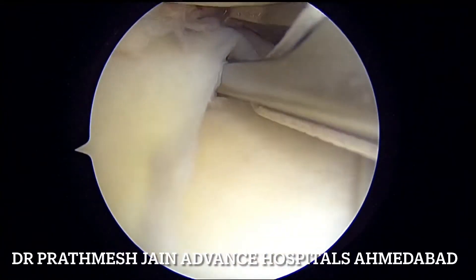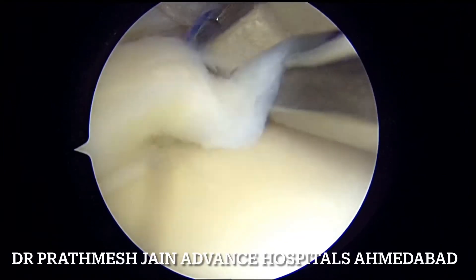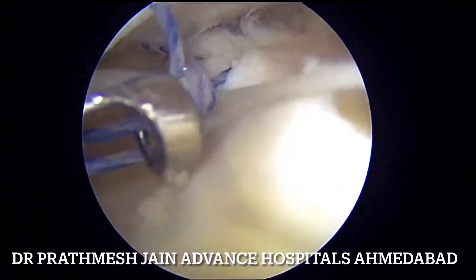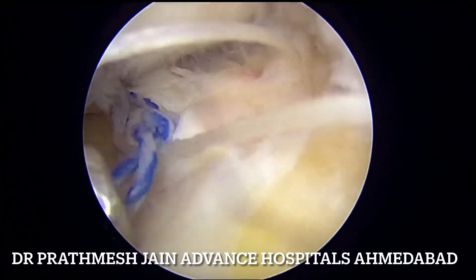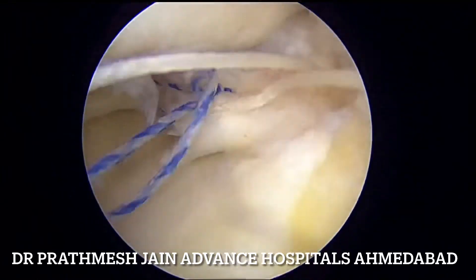This is the second suture — the first blue suture and the second white suture on the anterior component — and then we will be tying them side to side. This will be like a margin convergence as we do in the cuff, and this will lead to good closure of the anterior and posterior components in a very nice fashion.